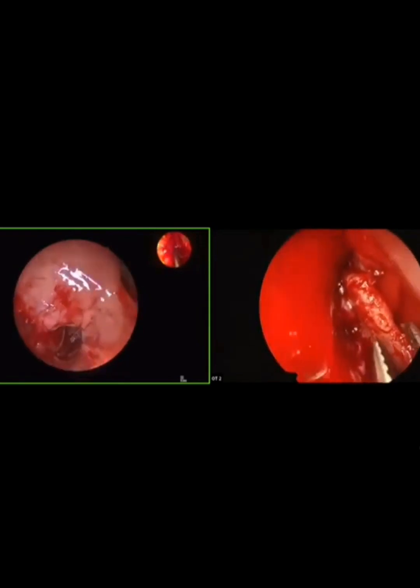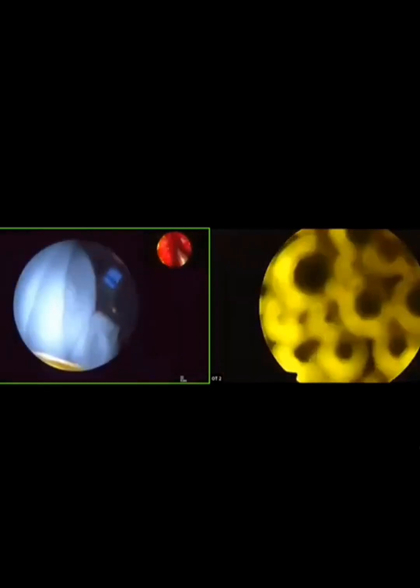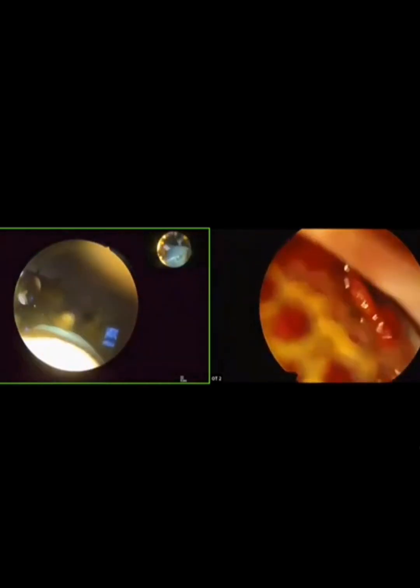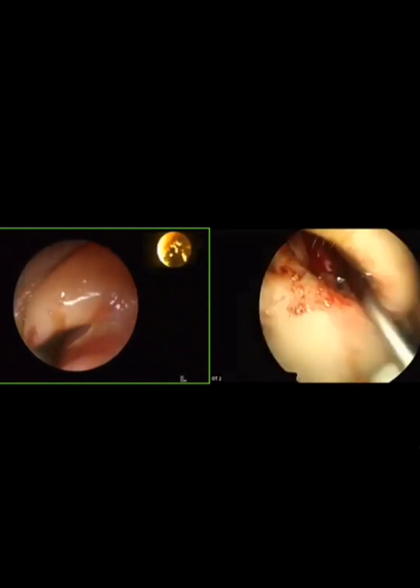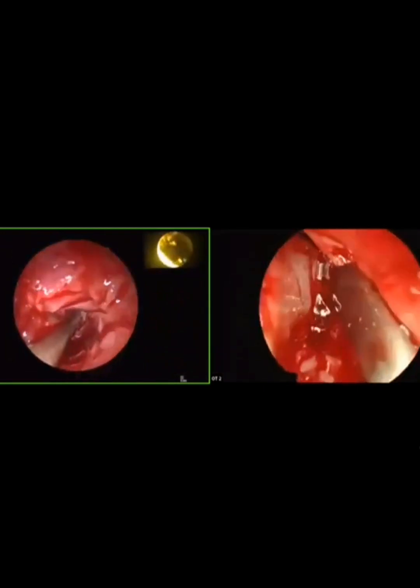You can do a little bit of work blindly also inside the frontal sinus if the sinus wall is intact. Do not push the debrider. Sometimes we have to do blind work inside the sinus by our tactile sensation.